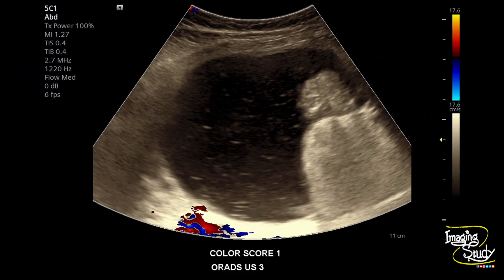Here is the color Doppler picture — you cannot see any flow within the lesion, so we are giving it a color score of 1. If you can see mild flow, the score would be 2; if moderate, score 3; and if you see gross vascularity, color score 4. If you see a dermoid with color score 4, it may not be a mature cystic teratoma but rather an immature teratoma.